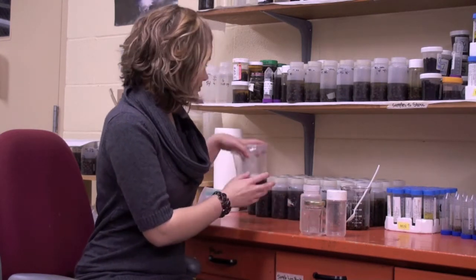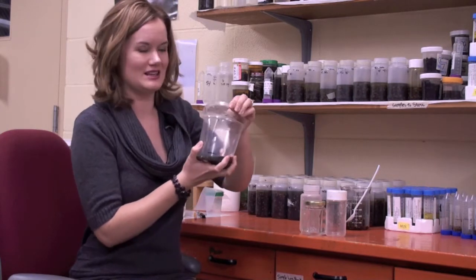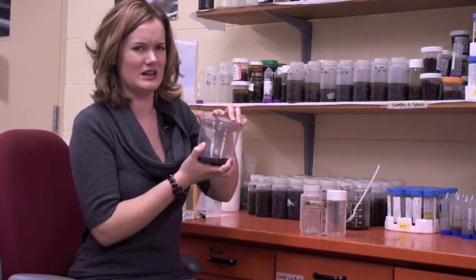A bad example of what to send me is something like this, just a regular kitchen food storage plastic bin, because it's easily opened and it's not very tight.